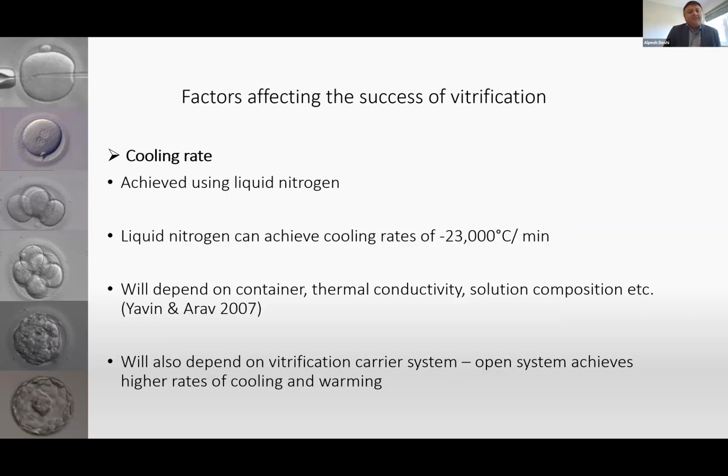So the factors that affect the success of vitrification, let's go into them one by one. One of the most important parameters is the cooling rate. Of course, we all know that those of us who perform vitrification have to have liquid nitrogen. The liquid nitrogen cooling rate should be around minus 23,000 degrees C per minute. That is the level of cooling rate we are expecting when we dunk our carrier in liquid nitrogen.